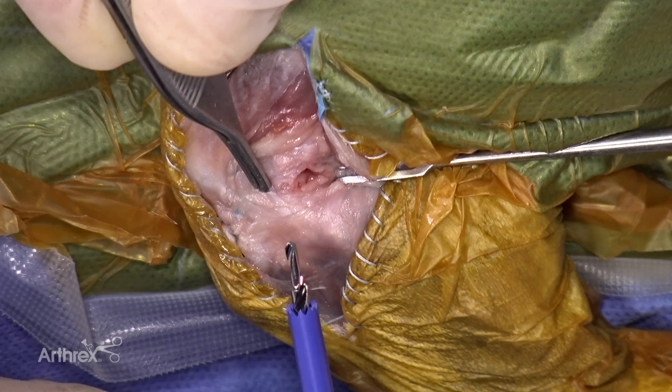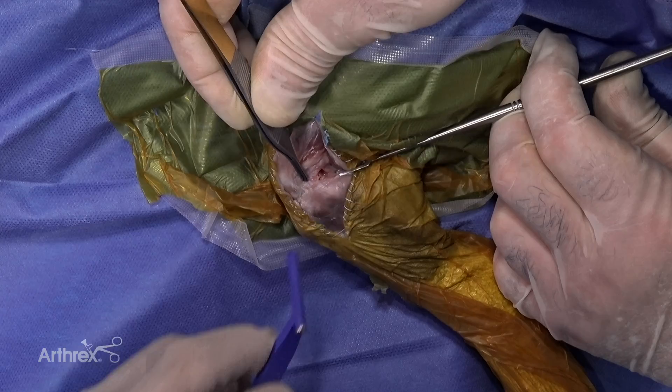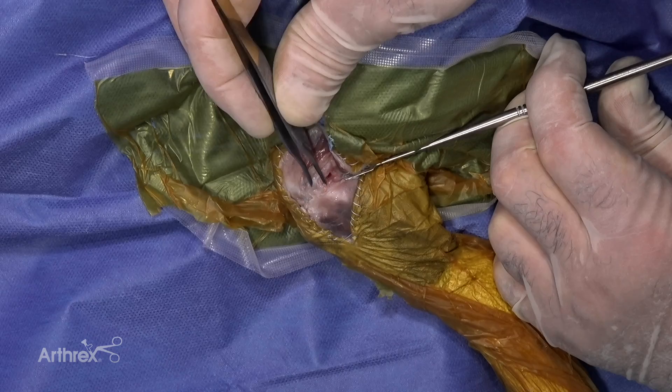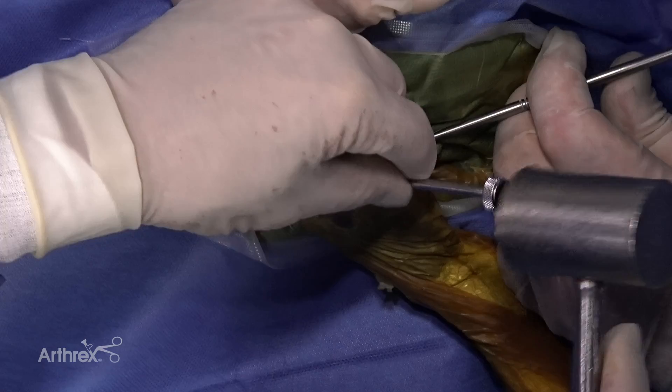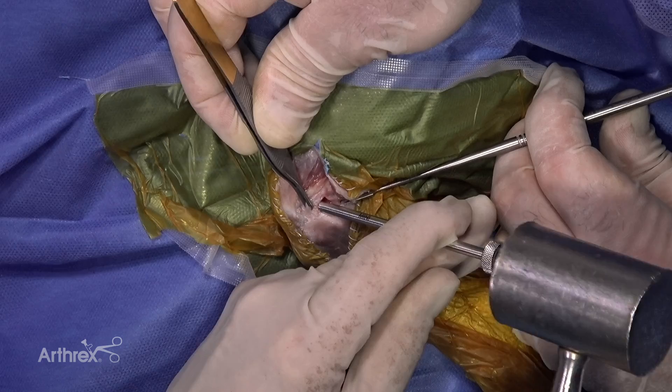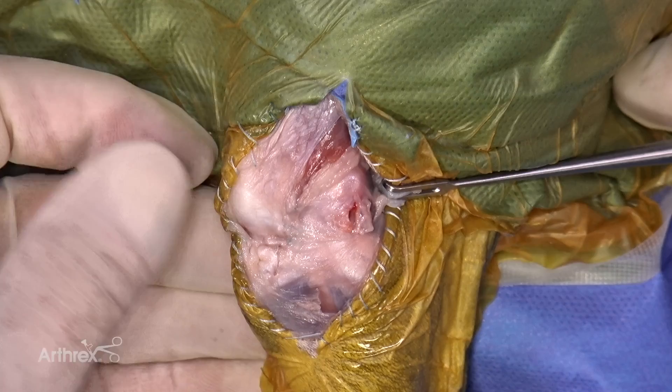This is the 1.8 millimeter drill bit with a guide and it has a stop — we're only going to drill to that depth right there. There's our pilot hole. Now I'm going to take the tamp again, place it in the hole, and tamp until the tamp is flush with the condyle. That assures the depth of the hole is adequate.